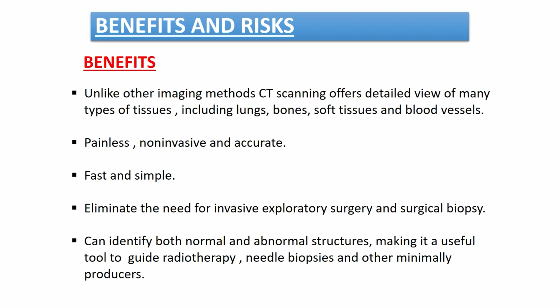Now, benefits and the risk. Unlike other imaging, CT scans offer a detailed view of many types of tissue including lungs, bone, soft tissue and blood vessels. It is a painless, non-invasive procedure and very precise, accurate information is given by this CT technique.